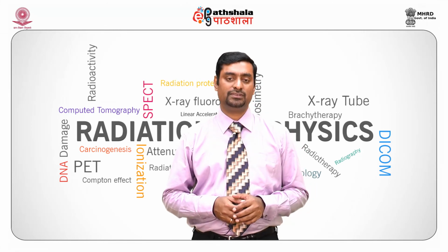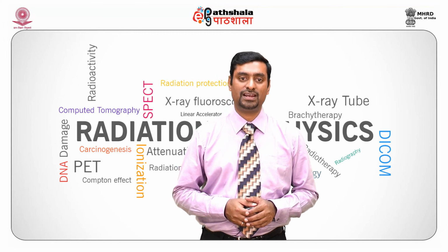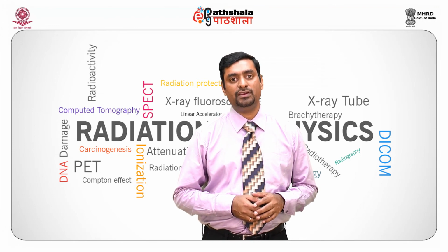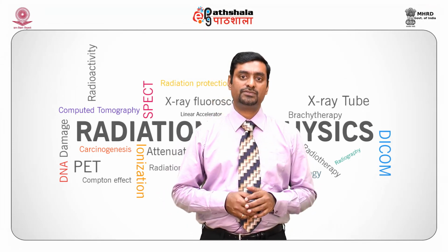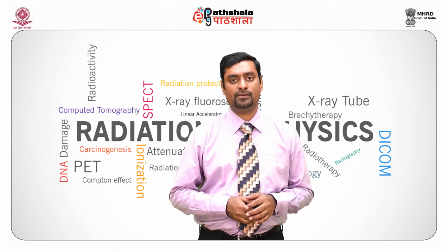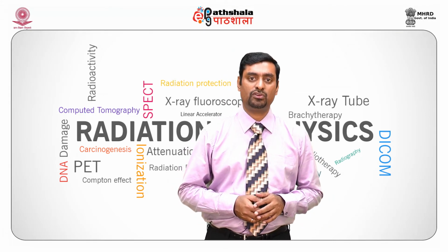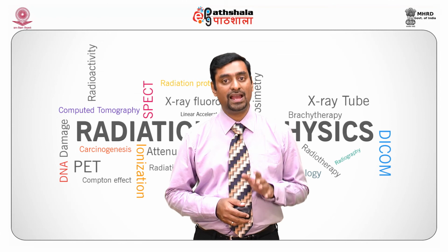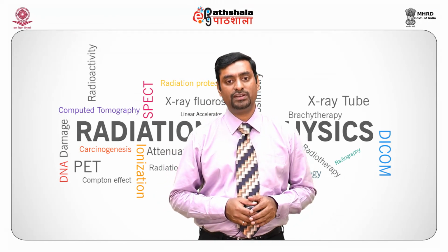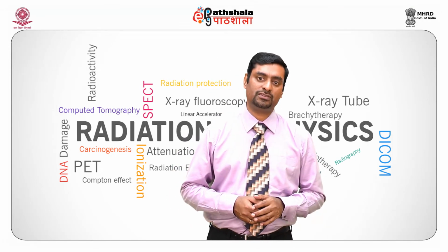What is mammography? It is a study that uses low energy X-rays for imaging the breast tissue for diagnosis and screening. The primary objective of mammography is to visualize low contrast visible mass and calcification, which may be about 100 microns in size. Molybdenum or rhodium are used as typical target material in mammography X-ray tubes. Anti-scatter grids are used in mammography. These grids have a lower ratio, and the material between these strips is selected for low X-ray absorption.